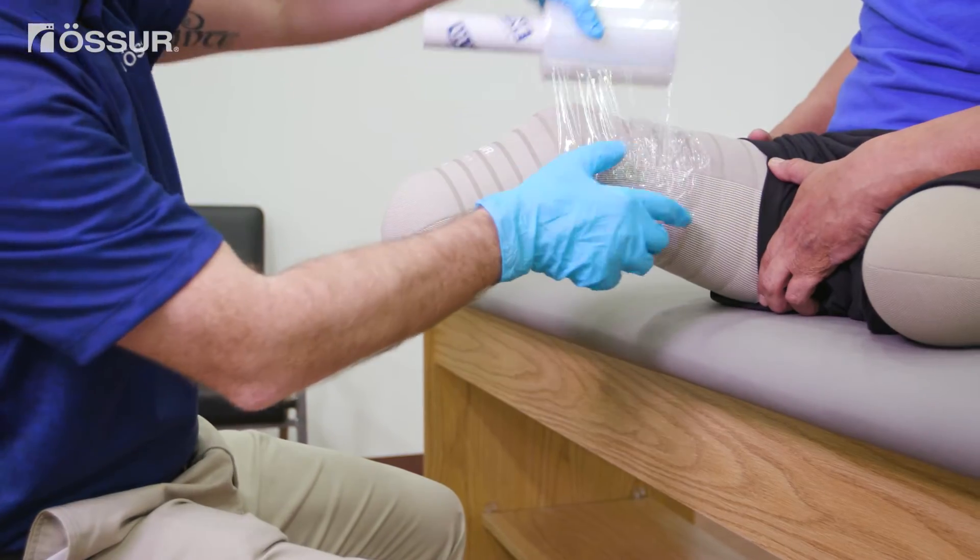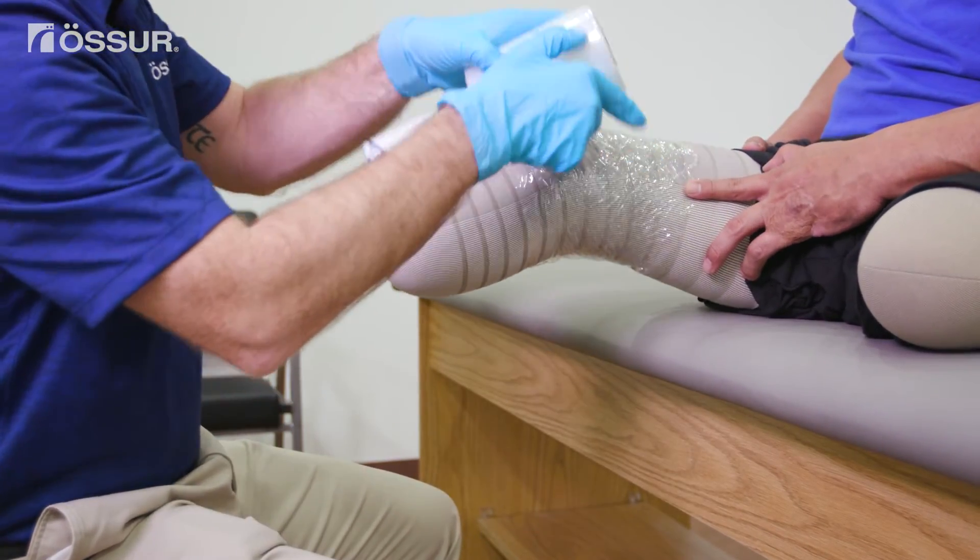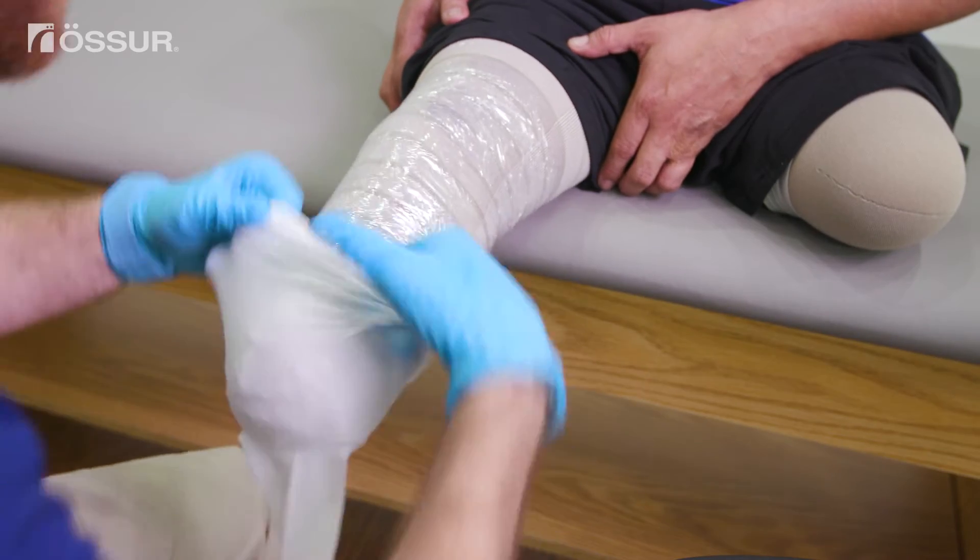The first step is to wrap the limb with plastic wrap to protect the liner fabric from your marker. Then cover the limb with a nylon.